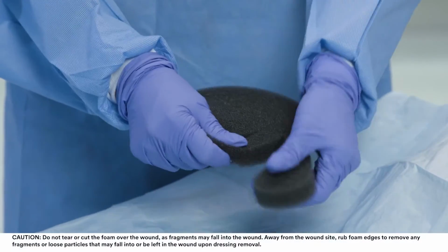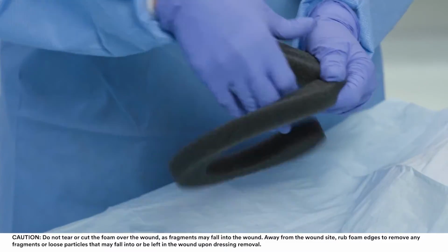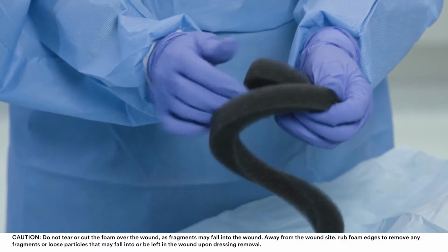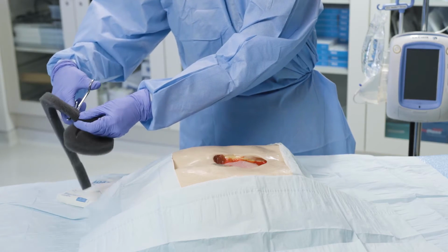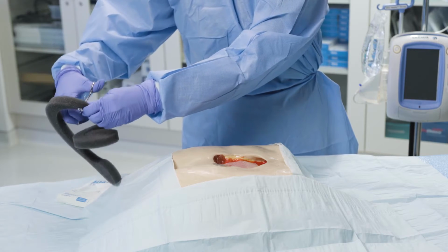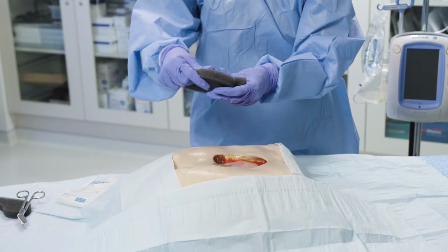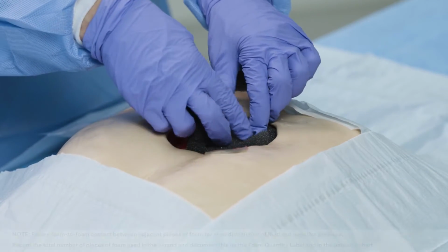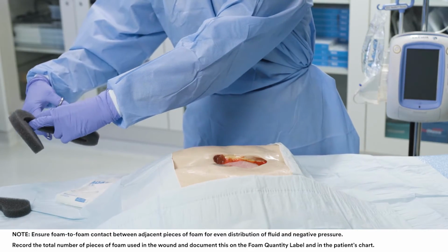Carefully tear or cut the foam to a size that will allow gentle placement into the wound without firm packing of the foam or overlapping onto intact skin. Gently place the foam into the wound cavity, ensuring contact with all wound surfaces. Do not force the foam into any areas of the wound.